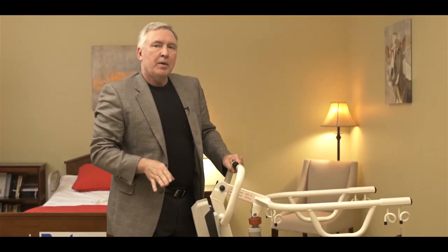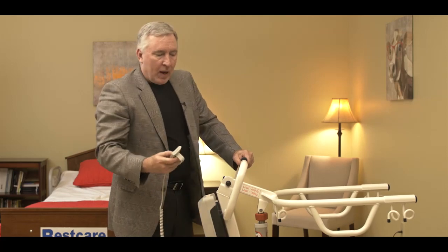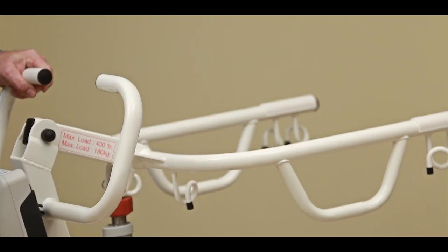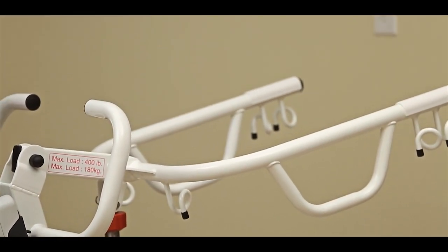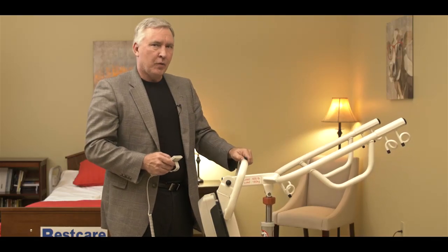This lift operates quite differently than the full body lift, because this lift is designed to stand a person up. So when we raise up the lift by pushing the button on the remote, you can see that it moves in an arc to get the person into a standing position. That's what's going to happen when we make the transfer with a patient.